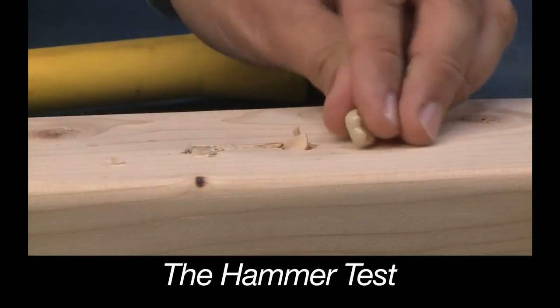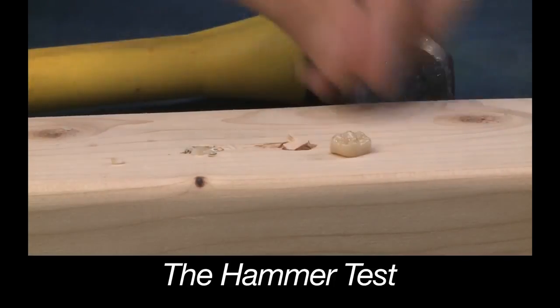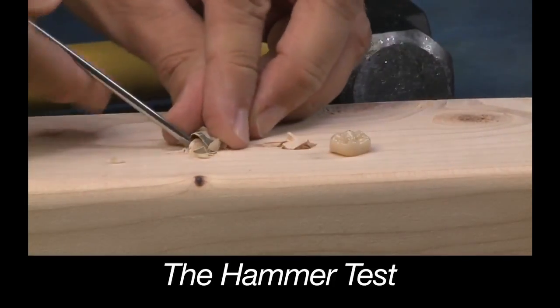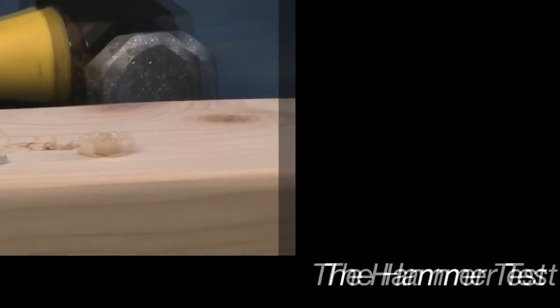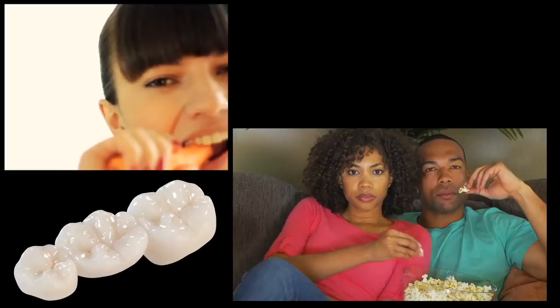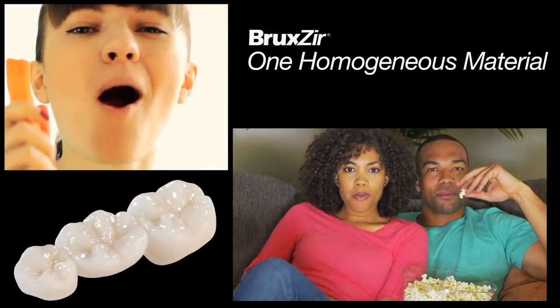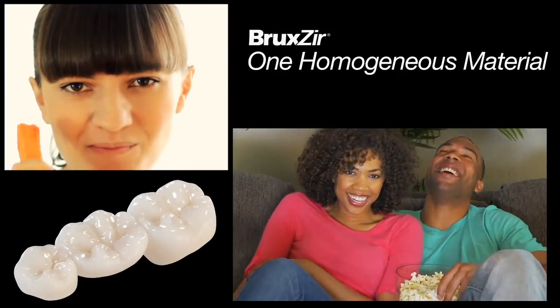So why are monolithic restorations like Bruxer stronger than layered restorations? When you take porcelain and layer it over a metal or zirconia substructure, there's always the possibility that these layers will come apart. There may be just some chipping on the porcelain, or the porcelain can break off altogether, exposing the substructure below. One of the major benefits of having a monolithic restoration is that nothing can chip off of it because it's made out of one homogeneous material.